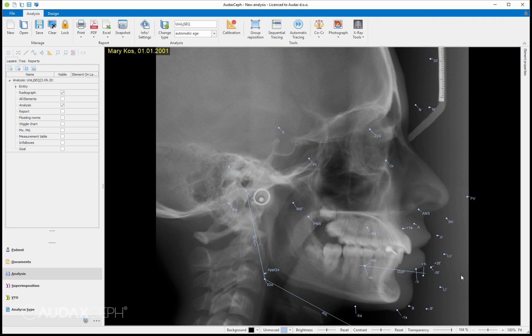Hello, this is Peter. I'd just like to explain things regarding the calibration. When you calibrate the analysis, you can see here the calibration button and there is a red dot there. That means that the analysis hasn't been calibrated yet.